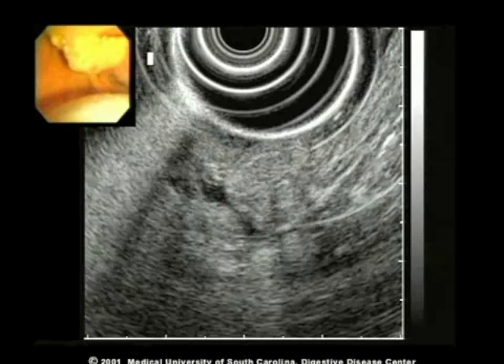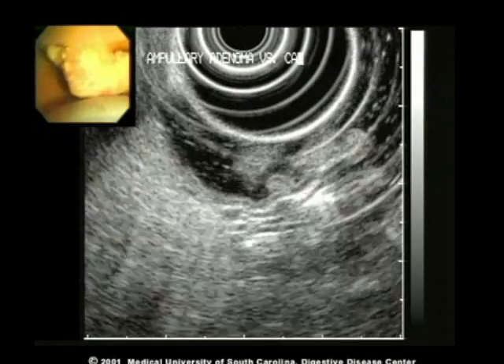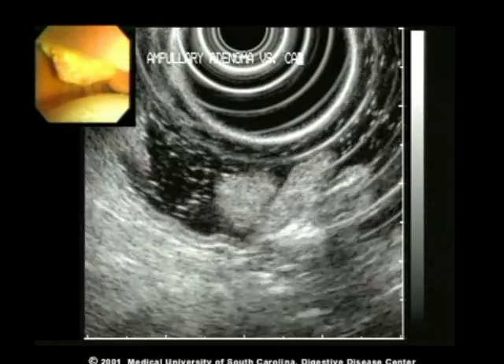With the transducer approximately one centimeter away from the ampulla, the lesion is seen in sharp focus. The small polypoid lesion arising from the wall of the duodenum can be seen at the bottom of the screen.